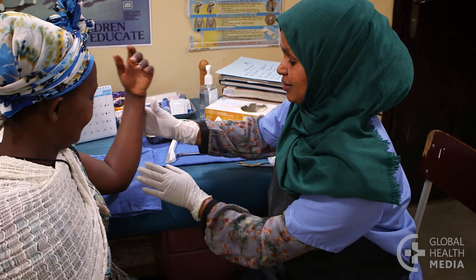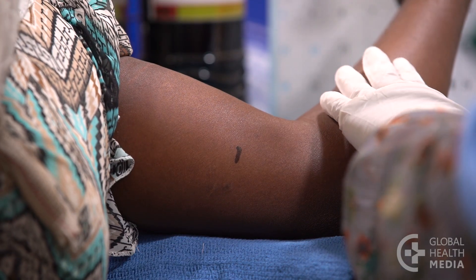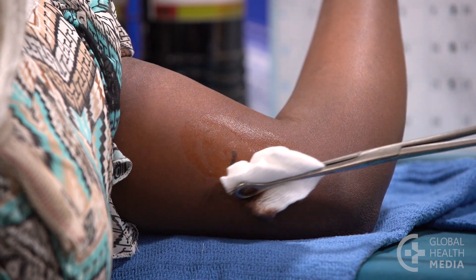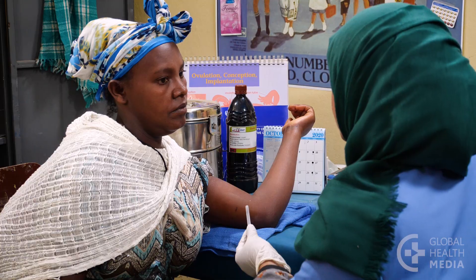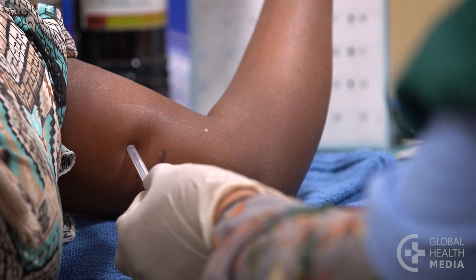Here's how the insertion is done. The procedure is done under sterile conditions. The rod goes in the arm you don't use as often, inside your upper arm. The provider will clean your skin with antiseptic, then inject numbing medicine just under your skin. This will sting at first, but after a few minutes, you won't feel any pain.